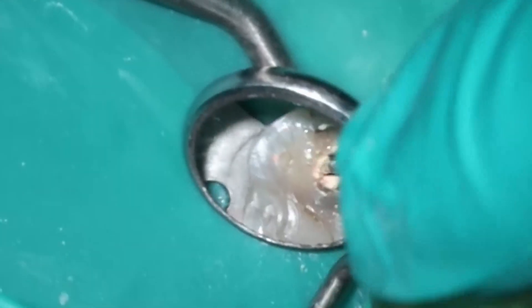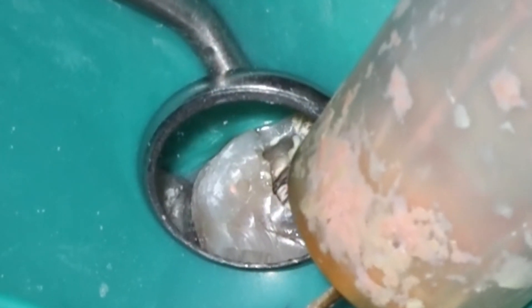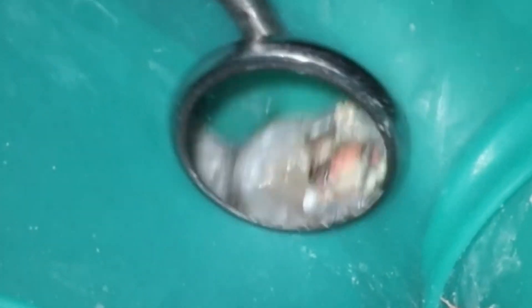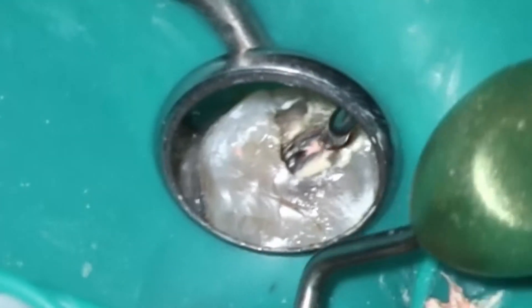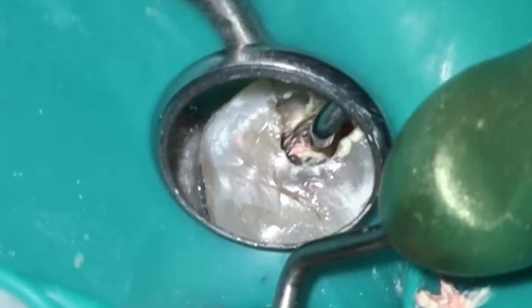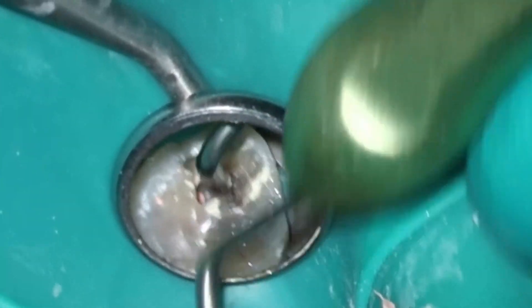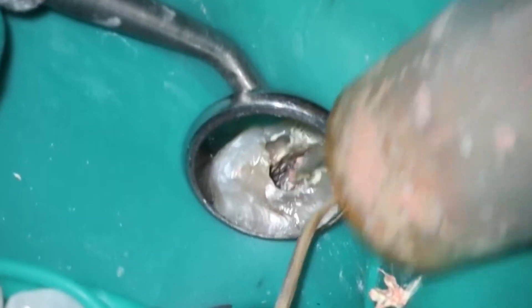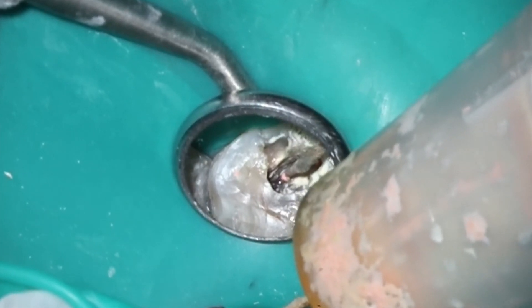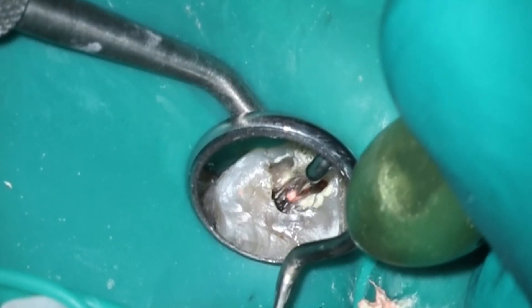Let's finish up this obturation. You'll notice I'm using the thicker end of the BNL beta condenser to sear everything off. When you have multiple canals, it's difficult in that final coronal three millimeters to get everything nice and sealed. Because it's sharp and has 90-degree angles, you can almost cut the gutta percha in, creating a really nice flat surface. One of my mentors always said the best endodontists take pictures, and clearly the best ones take videos — because there's no lying with a video. If I was just relying on x-rays historically, I would have left it completely flat and called it a day. Making it look pretty for the picture is really what I'm doing here.